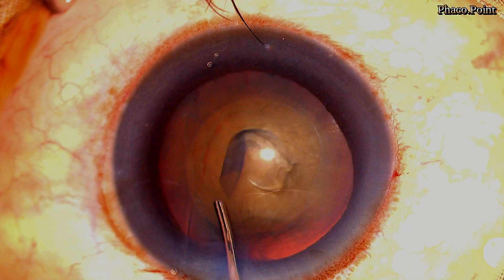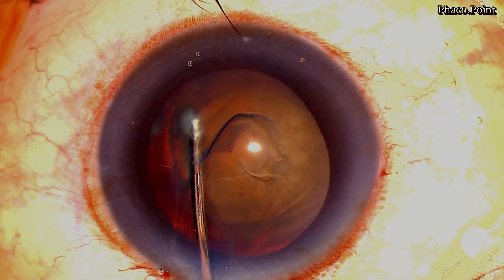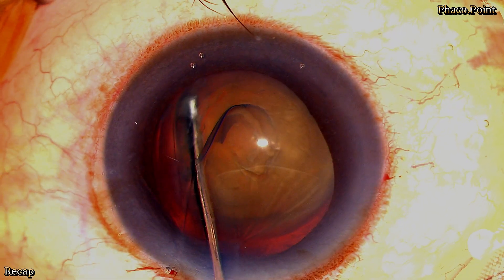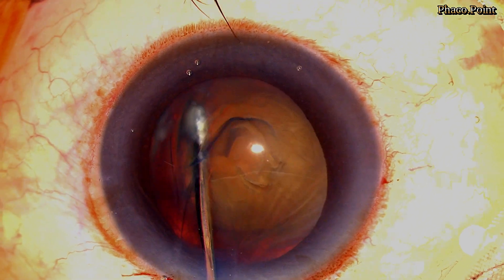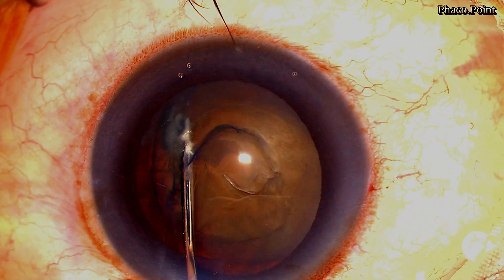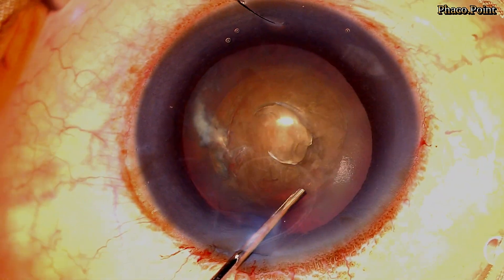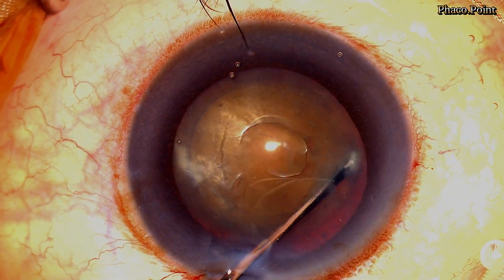We now proceed with the hydrodelineation. The hydrocannula is introduced into the anterior chamber deep to the rhexis and buried into the nucleus. Because of the density of the nucleus, the surgeon finds one particular place where he hitches the cannula against the nucleus and injects some fluid. Very often, as you can see here, there is no clear hydrodelineation wave that is seen. Assuming completion on one side, it is then repeated on the other side.